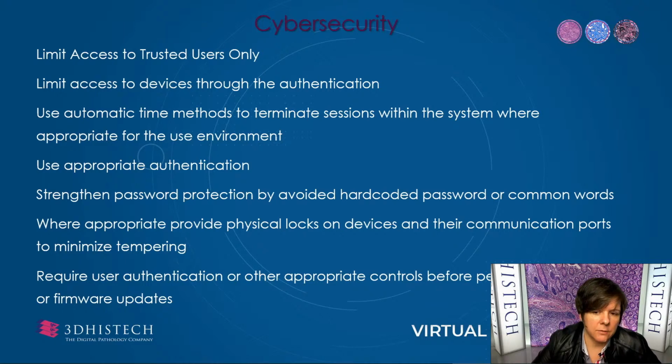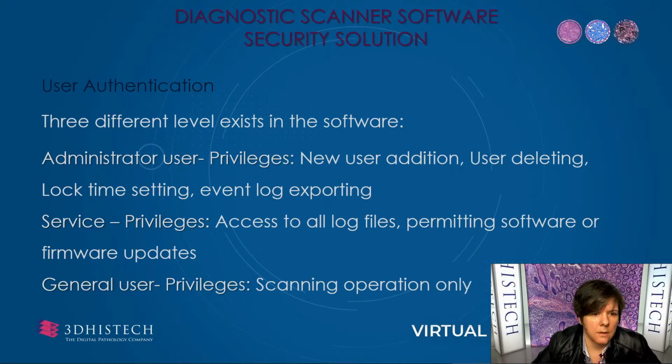Some of them are limiting access to trusted users only and using time methods to terminate sessions within the system. A strong password is also needed. Furthermore, it requires user authentication or other appropriate controls before permitting software or firmware updates. User authentication means to limit access to the devices through the authentication of users, so only a trusted person can access the system.